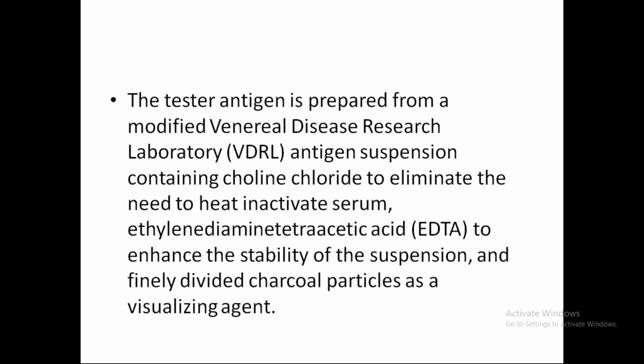The antigen has finely divided charcoal particles, which enable the person to visualize the result efficiently.